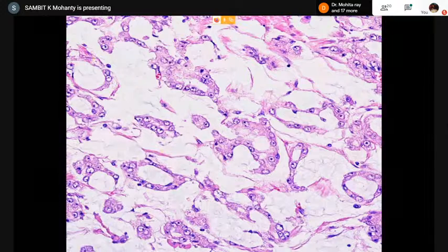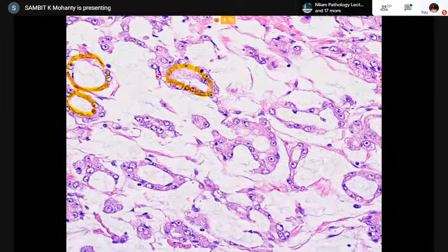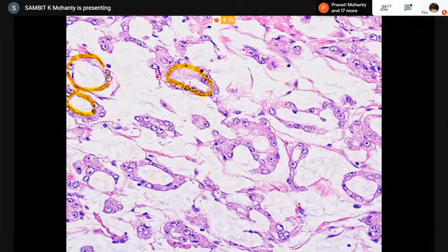So this one, if I say this one is a gland, right? And this one is a complete gland. And this one also is a complete gland. But there is a clue here. They look like complete glands, but these are not complete glands. They are squeezed, or there's so much mucin. They're giving a deceptive look of a complete gland. These are actually squeezed glands with mucin inside and outside. So they're actually all outside of the gland. And these are thin strands of cells.